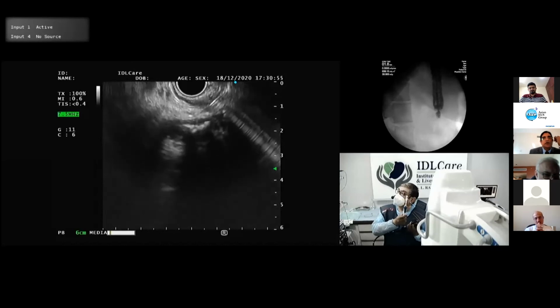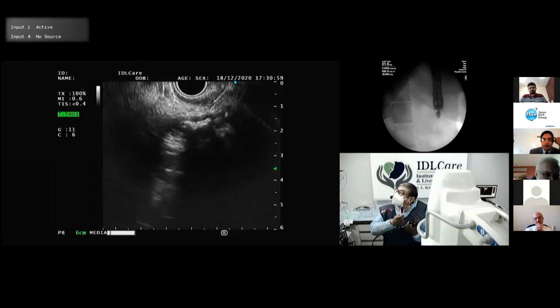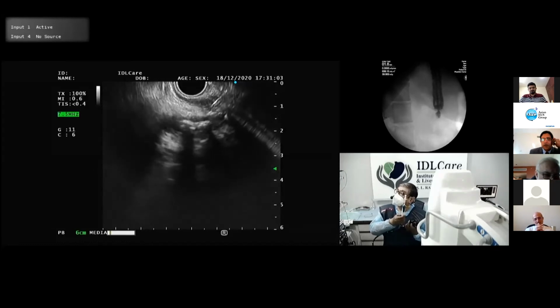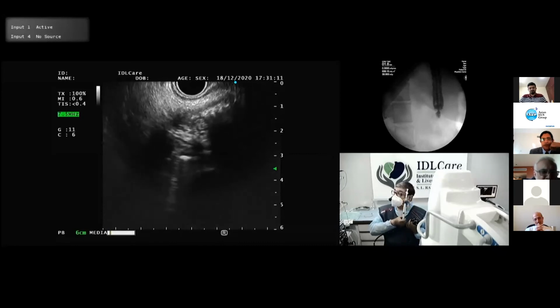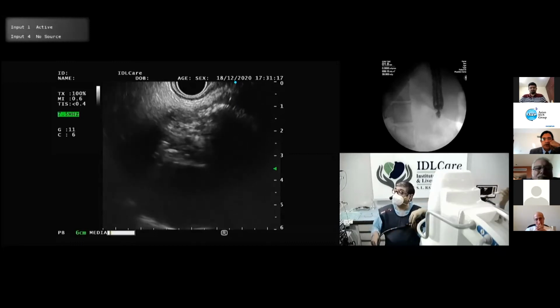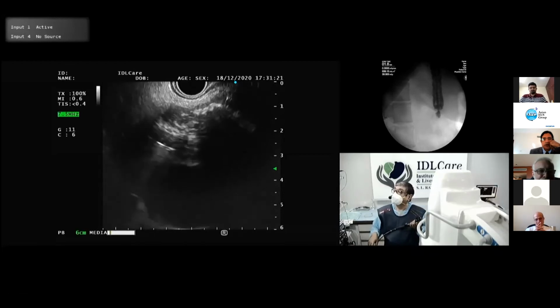Sir, will using a, sorry, I'm disturbing you. Give me an Olympus needle. Yeah, a 22 gauge needle and then using a 018 wire or something like that, do that? So, yeah, that's a good method. Unfortunately, 018 is not available in India. I don't have it. So, otherwise, you can use a 22.